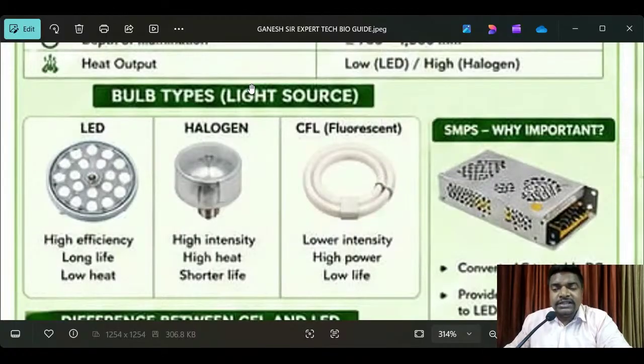In that operation theater, one CFL light, and that is a halogen light. With a halogen light, whenever there are high voltages and low voltages, the bulb will immediately blast and be damaged, and the filament is lost. This is the biggest disadvantage of a halogen bulb.